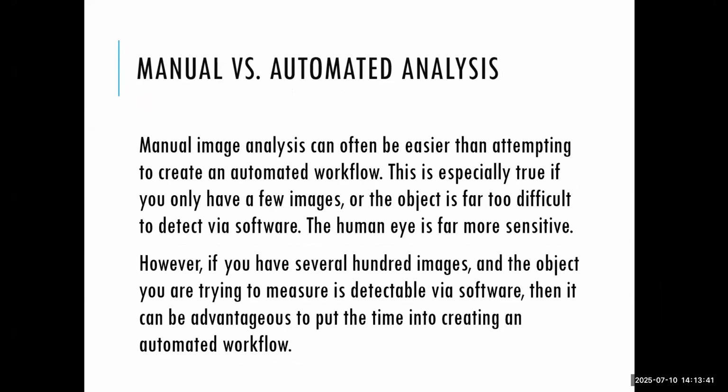The human eye is far more sensitive. However, if you can't determine if one object is 2 objects or 3 objects, if they're too clustered, then the computer will have absolutely no hope. However, if you have several hundred images and the object you are trying to measure is detectable via software, then it can be advantageous to put the time into creating an automated workflow.